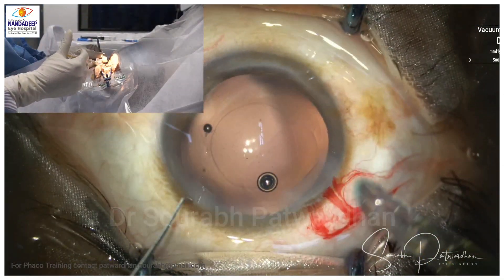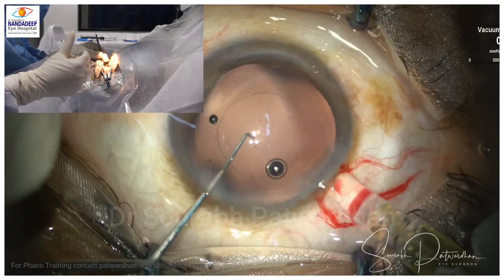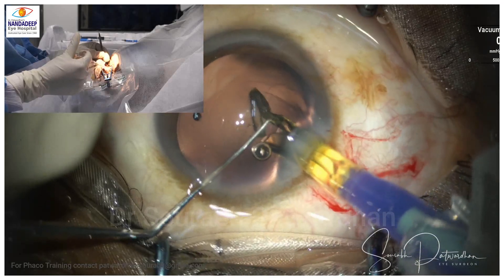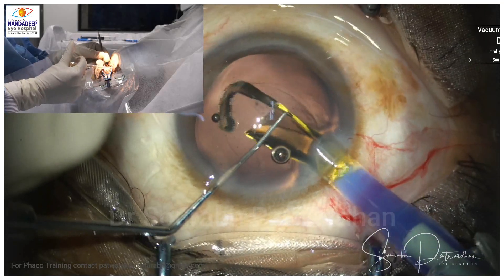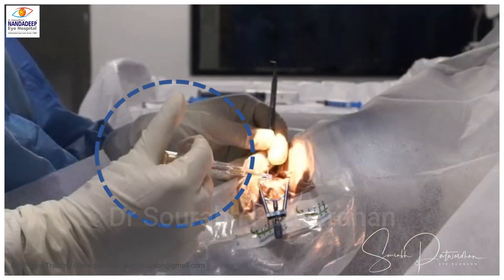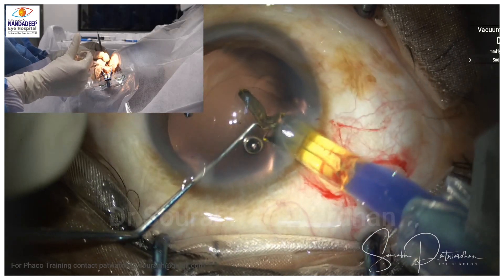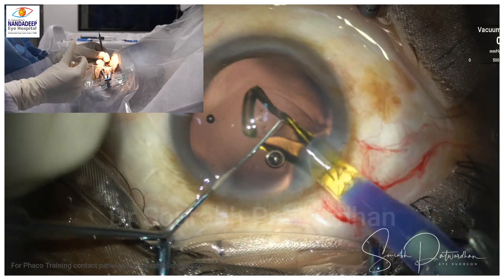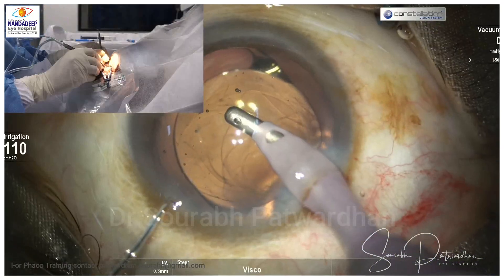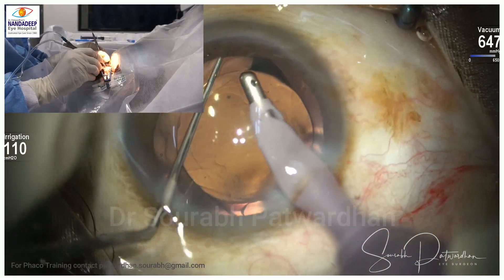Always remember the up approach and the down approach. Here I am showing how to push the IOL or any fluid inside the eye — I use the base of the thumb and not the tip of the thumb. That makes it very controlled, because the base of the thumb cannot move quickly, unlike the tip of the thumb which can shoot the IOL very fast and damage the posterior capsule. The same applies to fluids as well.